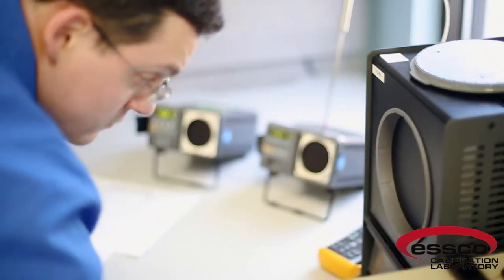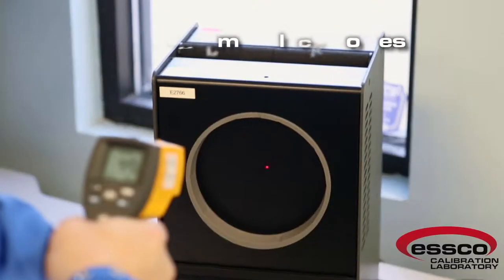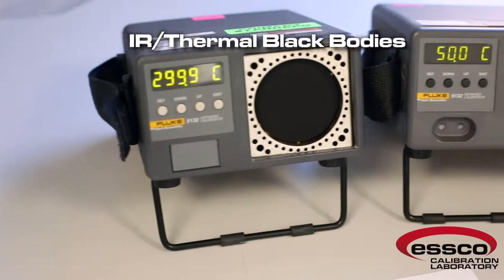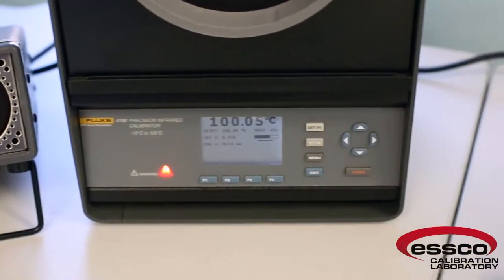In addition to temperature probes, we also calibrate non-contact IR guns and cameras from minus 15 to 500 degrees C, with an accuracy of plus or minus 0.5 to 8 degrees C, depending on the range.